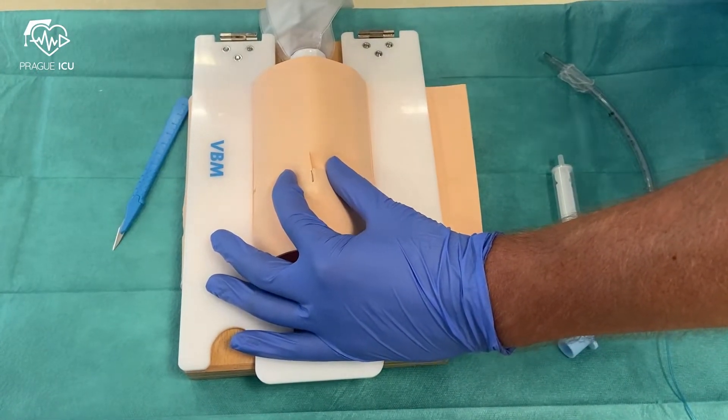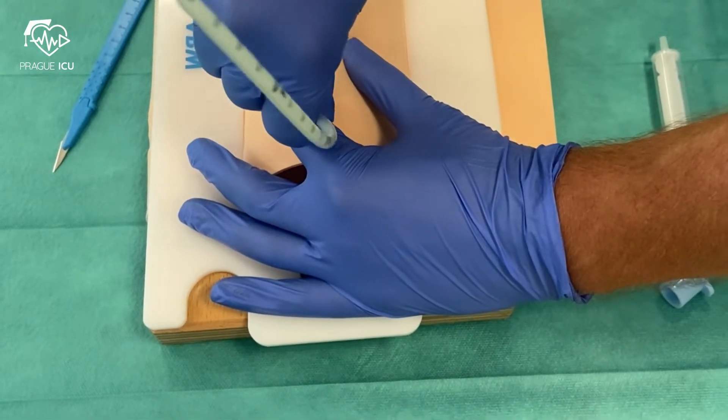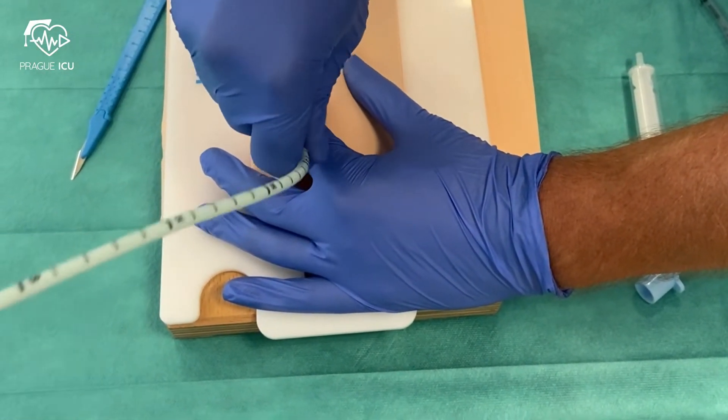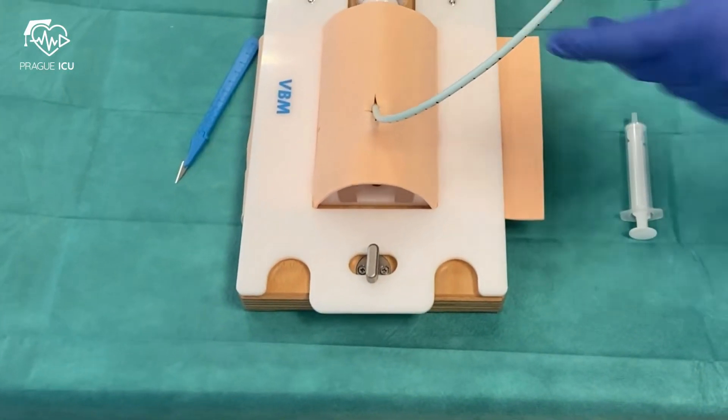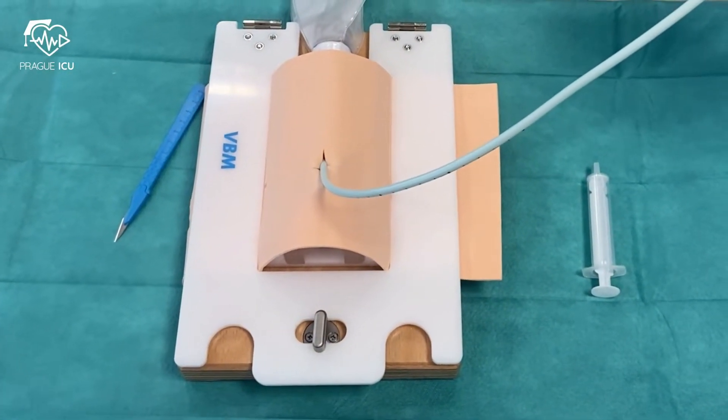Now take the bougie and insert it through the cricothyrotomy hole inside the trachea. Then slide the size 6 endotracheal tube over the bougie.